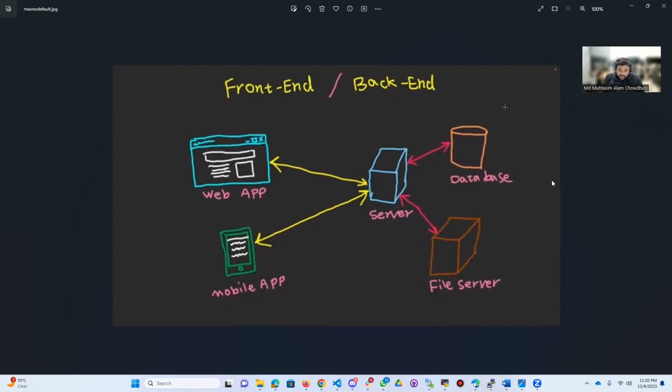Here we'll be presenting our heart rate monitoring system, the front end and the back end. This is going to be a description video and also a demonstration video, which is divided into two parts. The first one is the front end and the back end, basically the server side. And the second one is for the hardware side. As you can see here, we have a server and a database, and using the web app or the mobile app, we will be showing our work here.